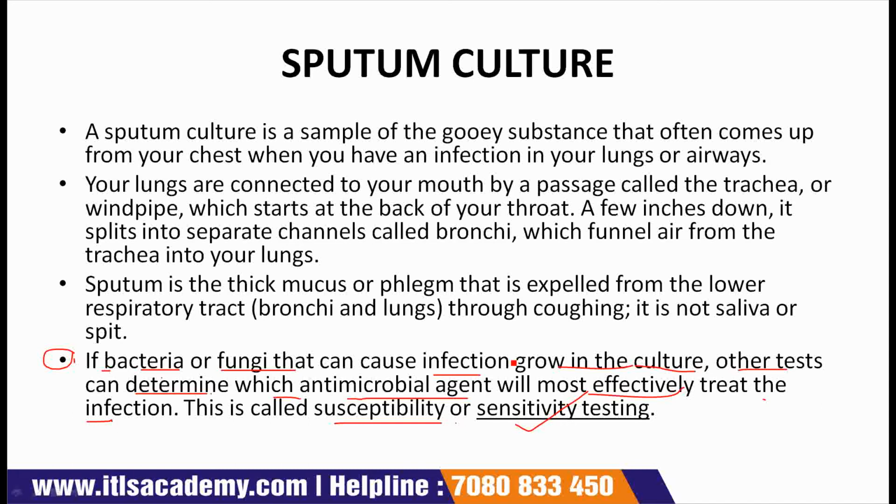Pure cultures of common respiratory pathogens in the absence of upper respiratory flora, combined with symptoms of respiratory distress, provide strong evidence of the infectious agent and also its significance.